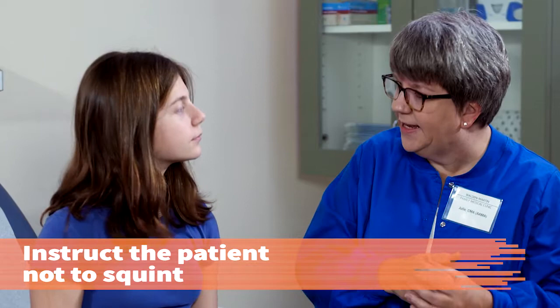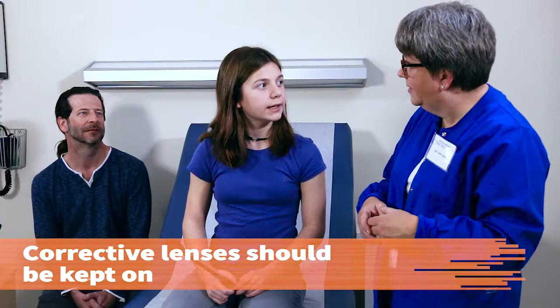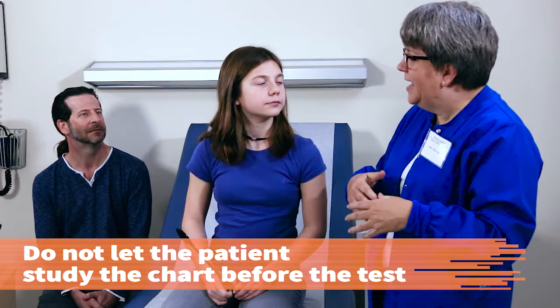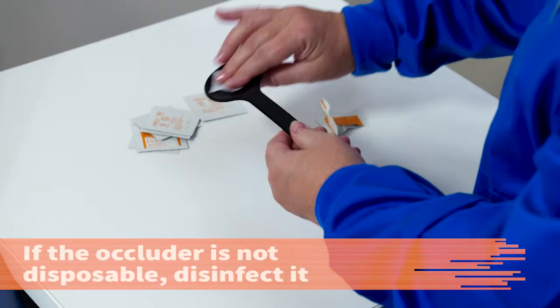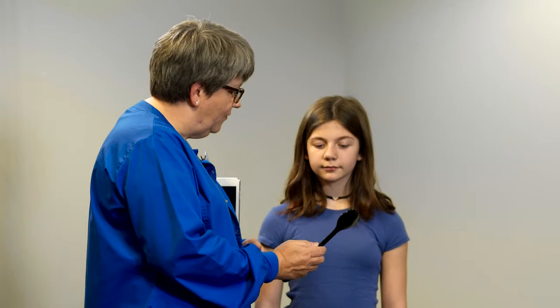Instruct the patient not to squint during the test because this temporarily improves vision. It's important that you don't squint while doing the test because that can affect your vision and we want to make sure we're getting a true picture of it. If the patient wears corrective lenses, they should be worn during the test. Be sure the patient does not get an opportunity to study the chart before the test is given or the results could be affected.